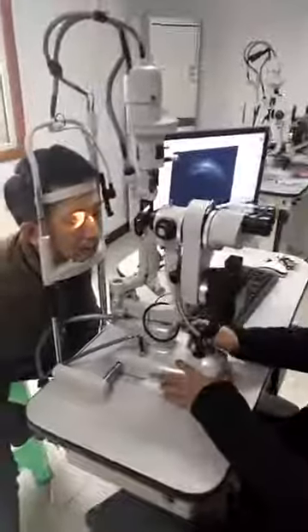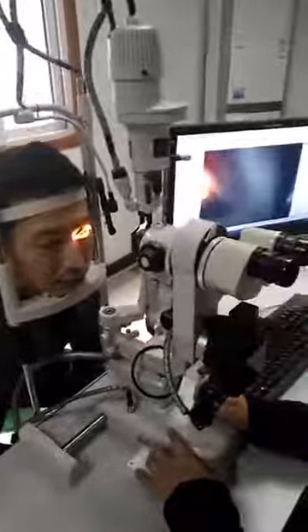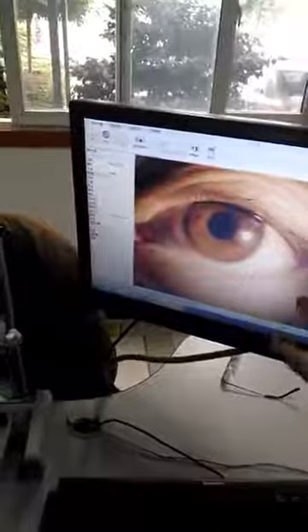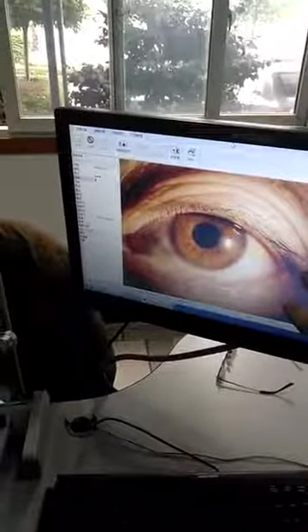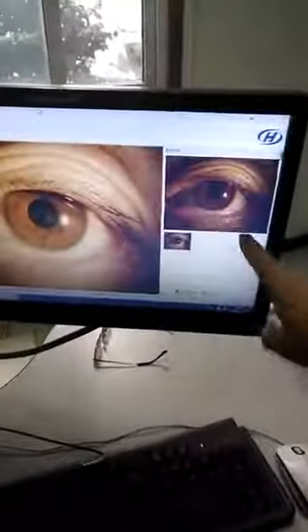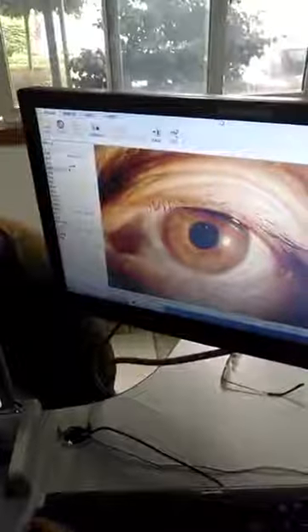Now I show you our digital slit lamp and how to take a picture. You can see the patient image on the screen clearly — very clear. If you think the image is okay, press the button and you can get a picture.